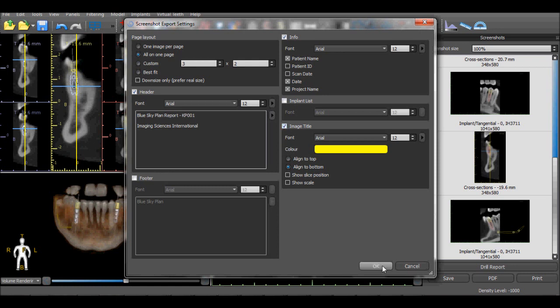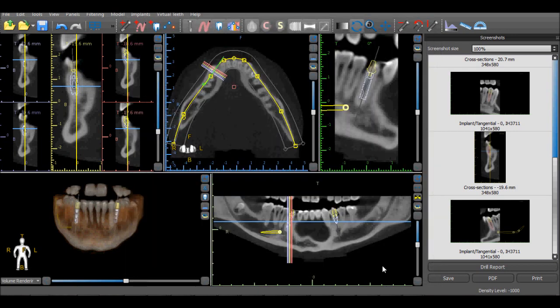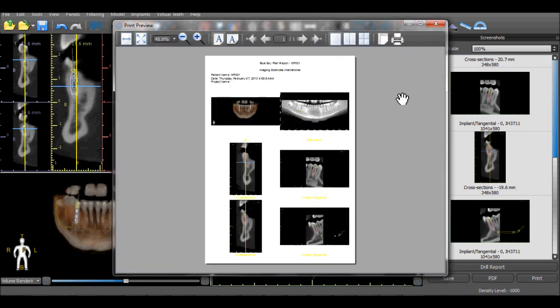Once the options have been selected, the OK button should be pressed and a preview of the report will appear on the screen. Select the Print option to print the report to your printer or to save it as a PDF.